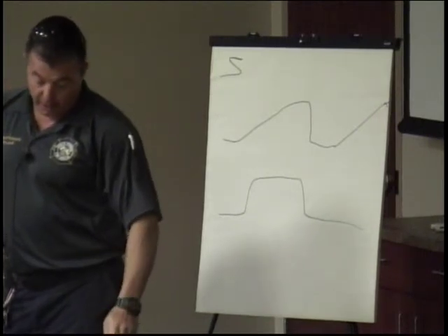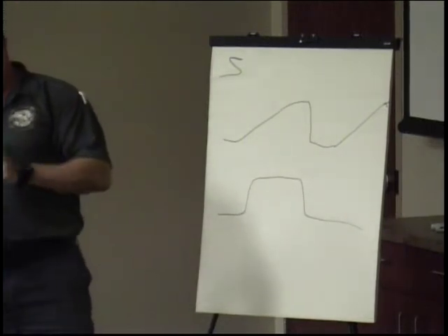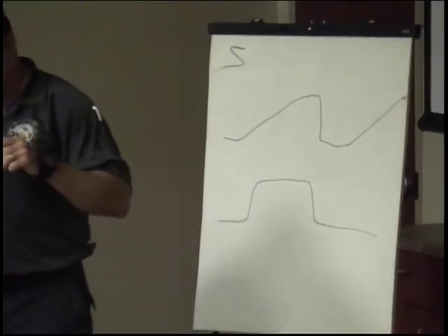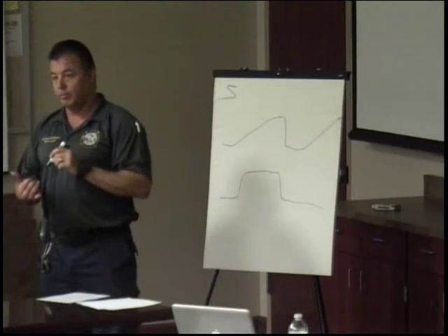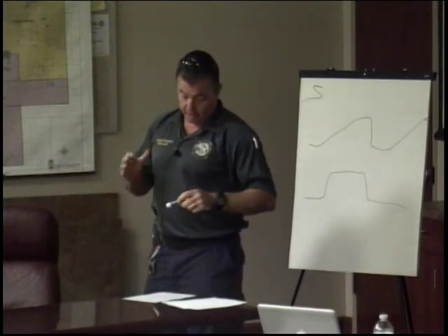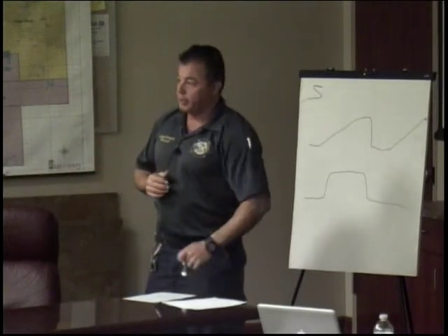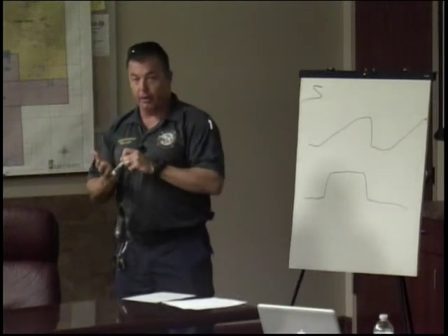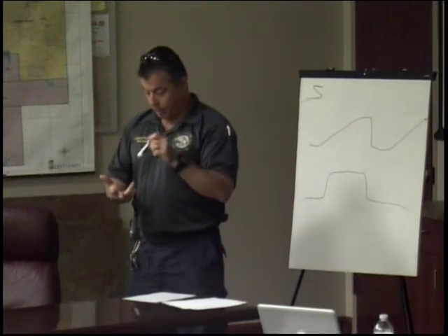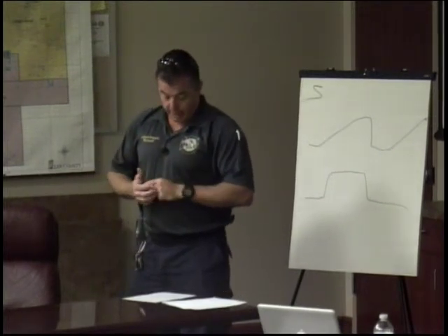A few other quick things. Monitoring their CO2 can help keep you from hyperventilating a head injury. It can help with shock patients or potential shock patients. You can follow those trends and those numbers to see when they have a drop in cardiac output, so you know that they're progressing into shock. Hyperthermic patients, either from metabolic reasons or RSI, their CO2 is going to rise in a hyperthermic patient, which we could see here.